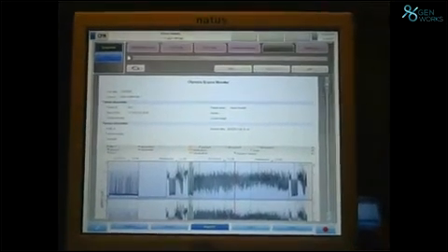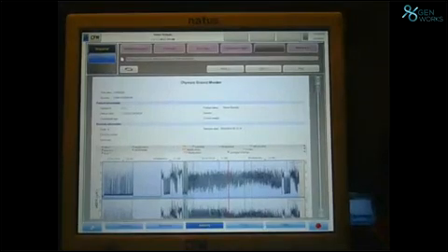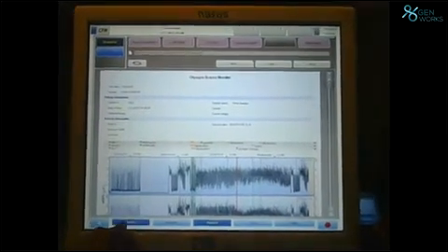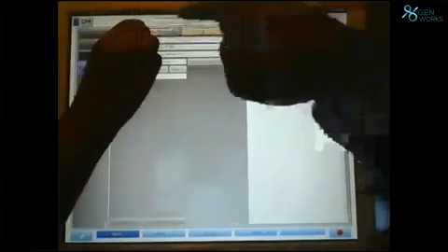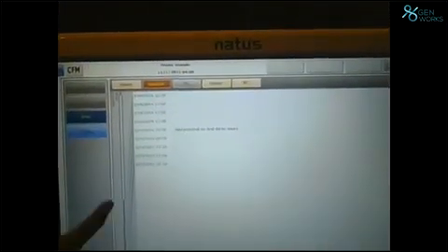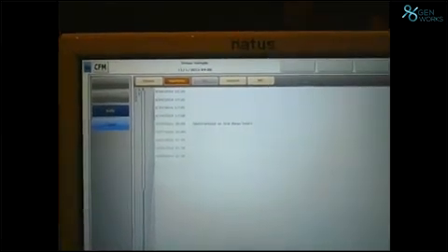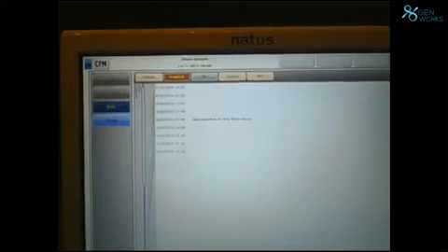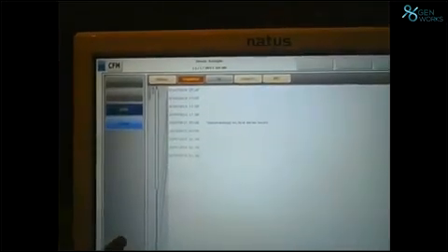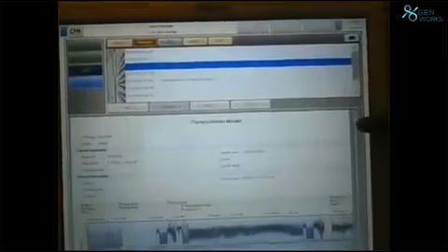Like that, sir, every 3 hours, how many printouts should I give, somebody might ask. Number one, very clever here. Go to the patient once again and go to the snapshots. See, can you people see this, please? Whatever time we have taken the snapshots, because each window is 3 hours, each 3 hours the sister can take the snapshot and keep it for the doctor for reviewing. This is beautiful. Yeah, show them. See, it has come like this.